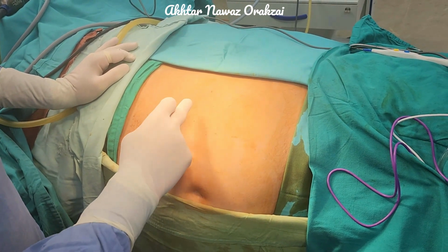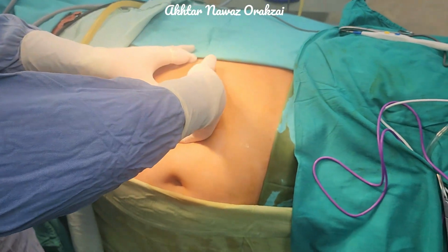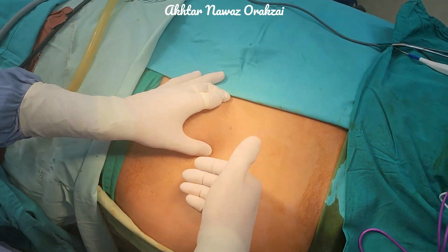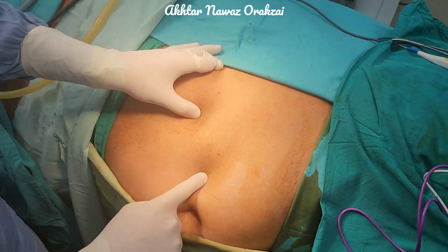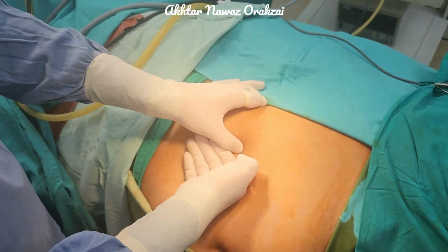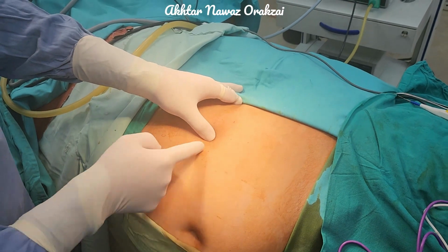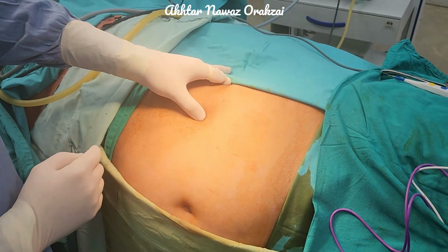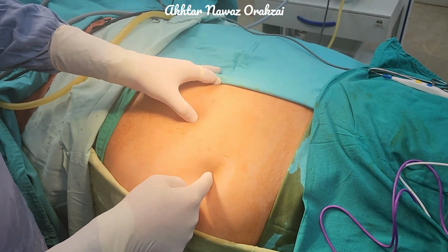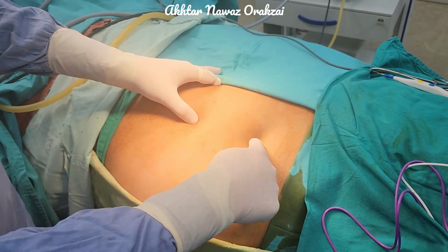The second port, which is the working port, will be a 10 millimeter port, and this will be 7 centimeter below the optical port. So it comes out to be here. And the third port will be 7 centimeter from the optical port and 10 centimeter from the other working port. So this will make a triangle. And at times we also put in another assistant port, so we make another triangle. The third port or the fourth port, the supportive or the assistant port, comes here.